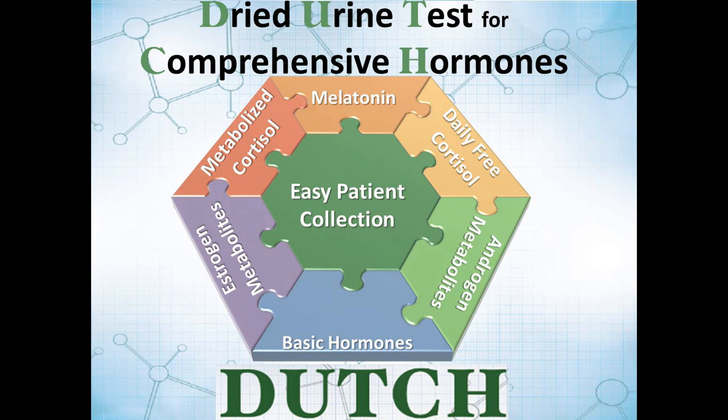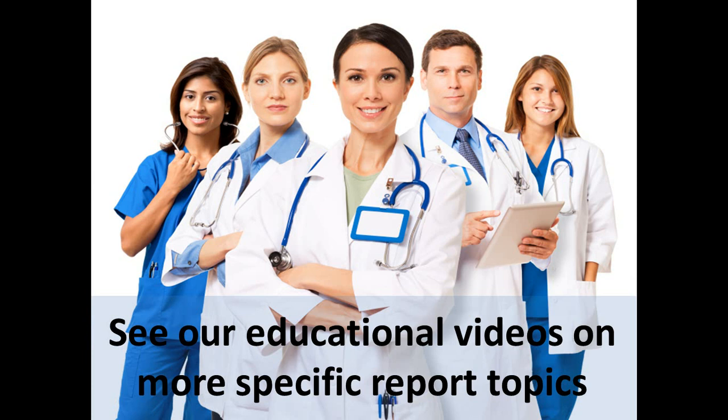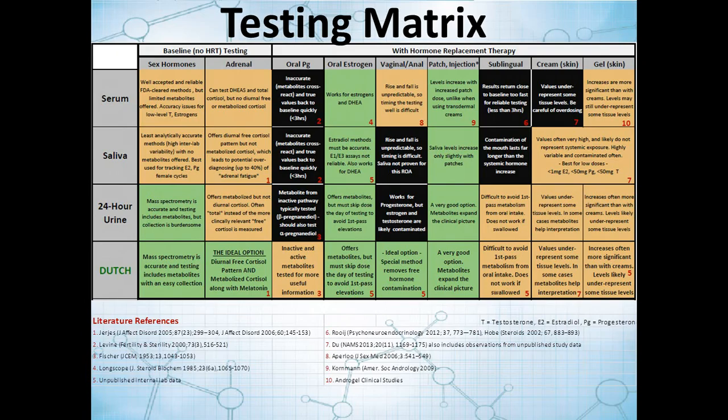This is for our dried urine test for comprehensive hormones that we call Dutch. And we do have other educational videos on our website, so do be aware of those. Those are on various topics.